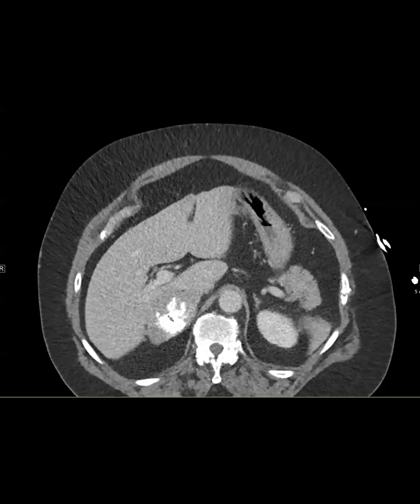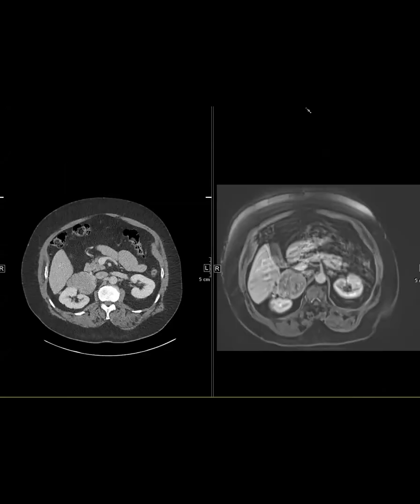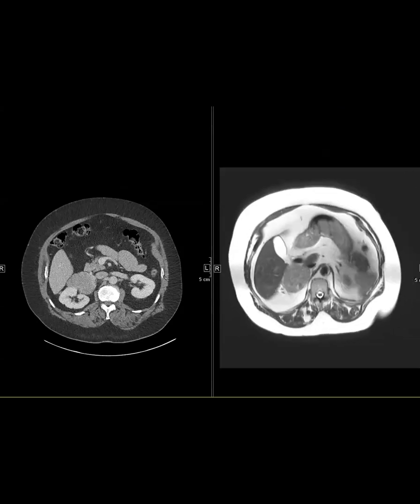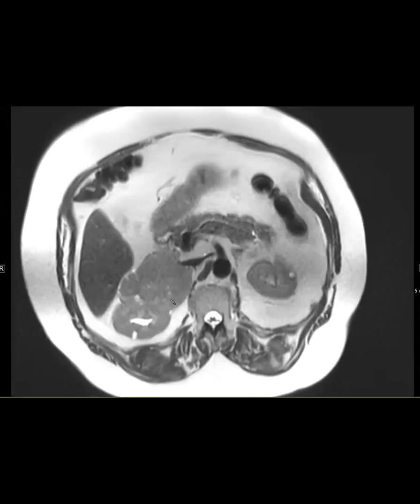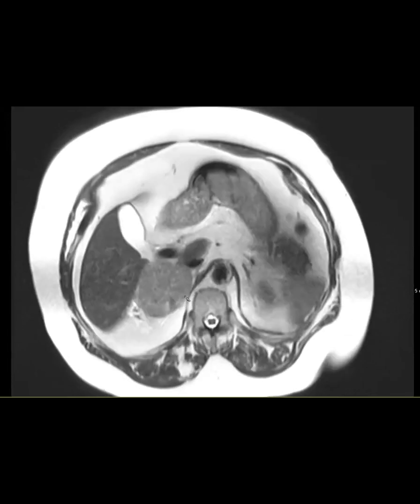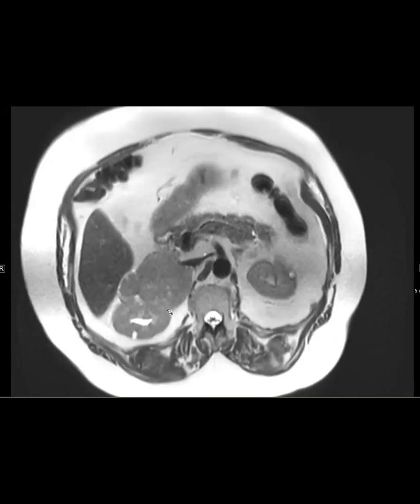Does the calcification help you at all? Does the T2 help you? So we were thinking either a pheo or an adrenal cortical carcinoma. The clinician said the patient was very hypertensive and so was favoring a pheo, but we were favoring an adrenal cortical carcinoma. And one reason was it wasn't super bright, although only 40% of pheos are light bulb bright.